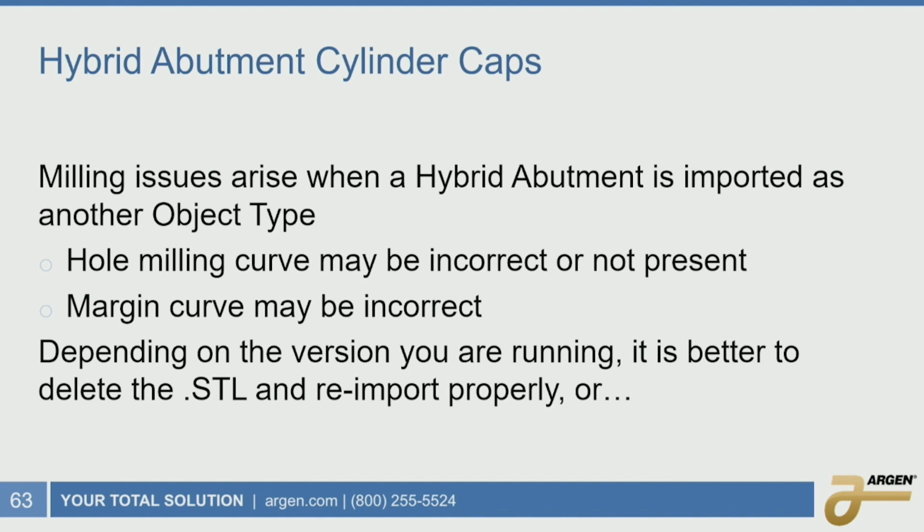90% of the time it has to do with those red caps having been removed, or when it was brought in from the CAD software, that information wasn't brought in, and it didn't actually identify those areas.